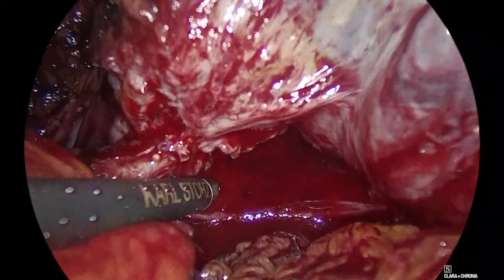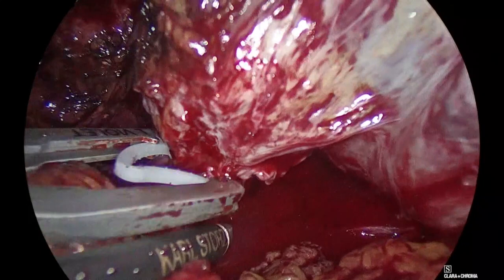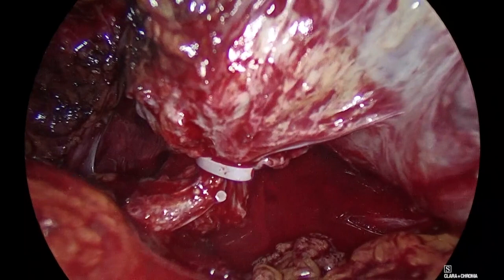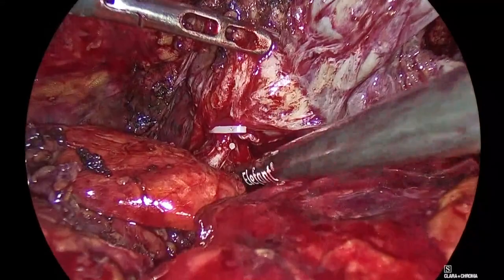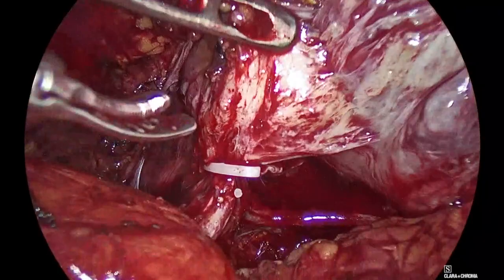But at least go back for a second. Good. Come in. Very good. Strong grasper. This one? Yes, it's fine. So you see, it's a stepwise thing. Go back. Clean under there, Panagiotis. No rush. No ischemia time. Go left. Come to me.